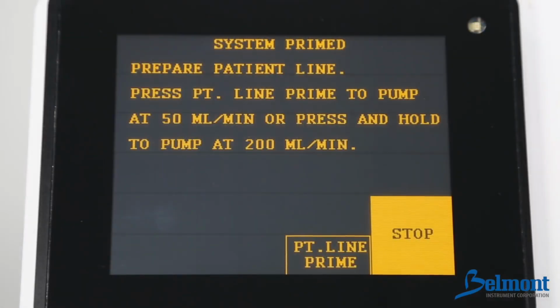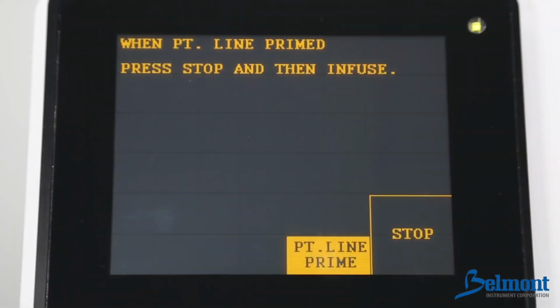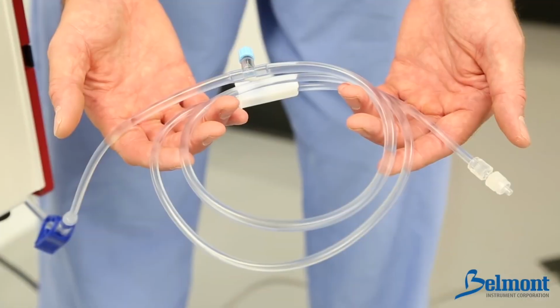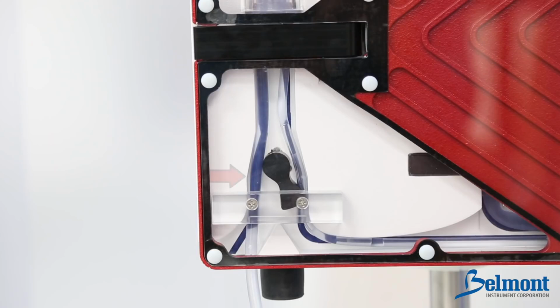The next screen will prompt you to prime the patient line. Press the patient line prime key once to prime at 50 milliliters per minute, or press and hold the prime key to prime at 200 milliliters per minute. Press stop after you have confirmed all air has been purged from the patient line. The system automatically enters a standby mode until you are ready to connect to the patient's catheter. Before continuing, please inspect and make certain that the patient line is completely primed and free of air. Any air bubbles after the patient's safety valve wand must be removed prior to patient connection.